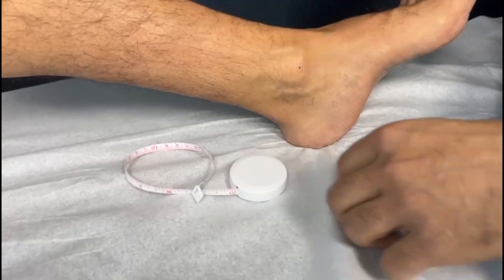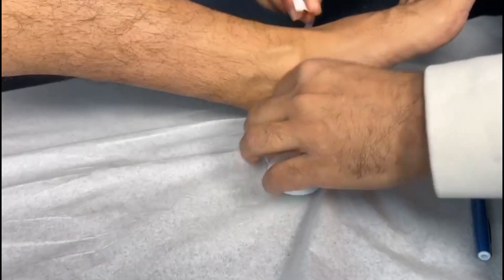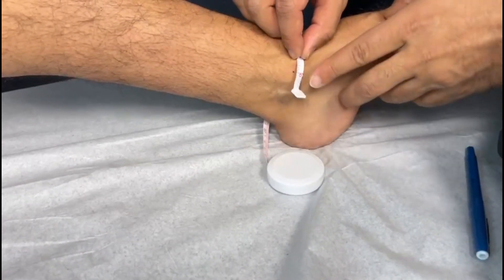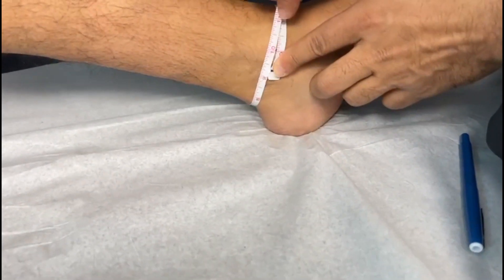The brace should fit comfortably around your ankle with no slack or gaps. If you have a high instep or a narrow foot, we recommend going up one size from your actual measurement so that the brace can fit securely without slipping down into the shoe.